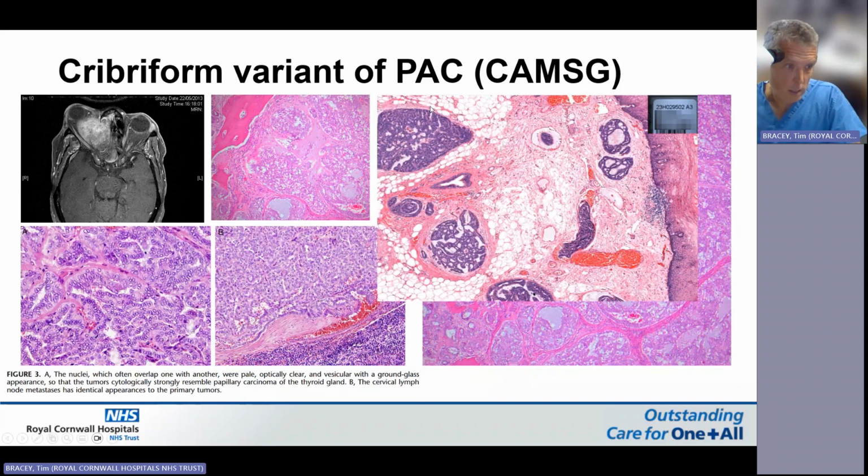Well, this is one that Susie and I diagnosed recently, again, a palate tumor. And this behaved very aggressively. It was a late diagnosis. The lady had neglected it. And it showed extensive vascular invasion. Here's a vessel with tumor snaking down it. And this had quite good papillary thyroid nuclei as well.